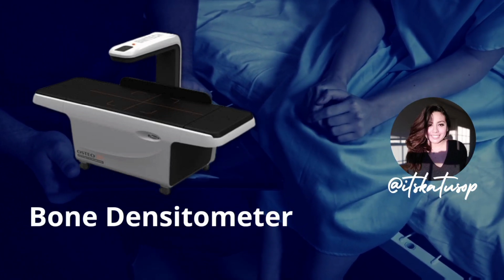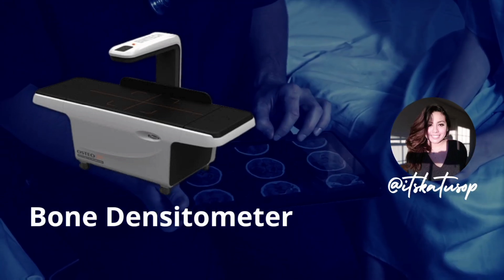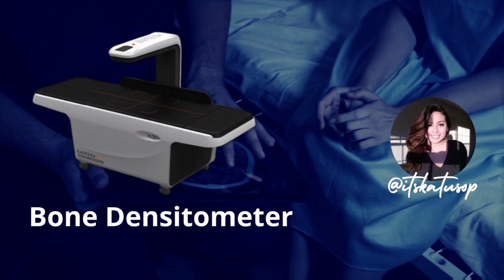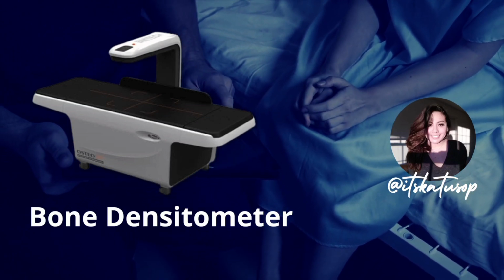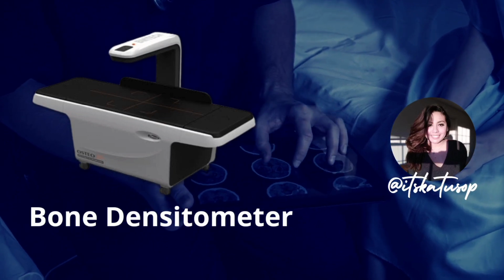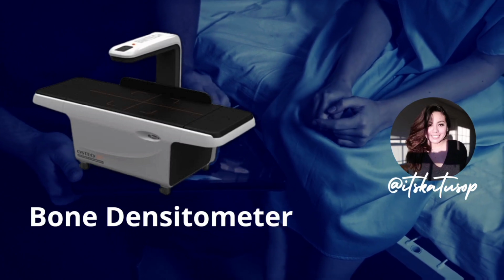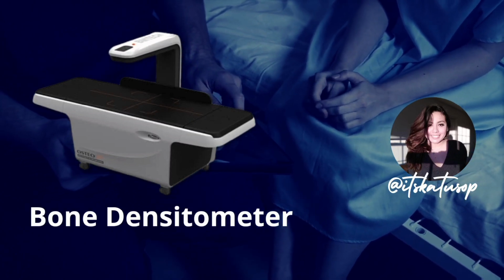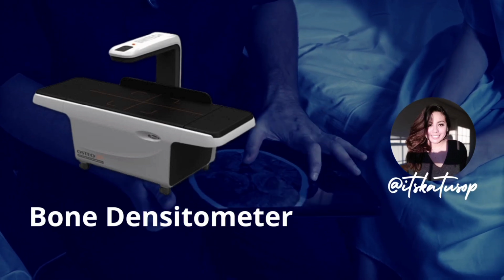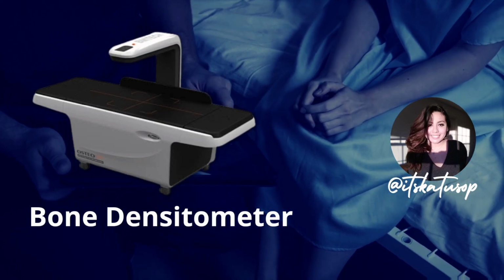So how about the results? How can you interpret the results? The results of the scan are usually reported in terms of T-scores, which compare the patient's BMD to the average BMD. A T-score of -1 or above is considered normal, anything between -1 and -2.5 is considered low bone mass, or in medical terms, osteopenia, and -2.5 or below is considered osteoporosis.